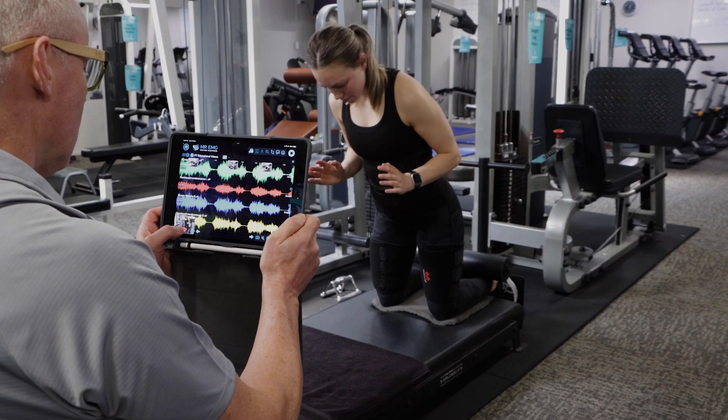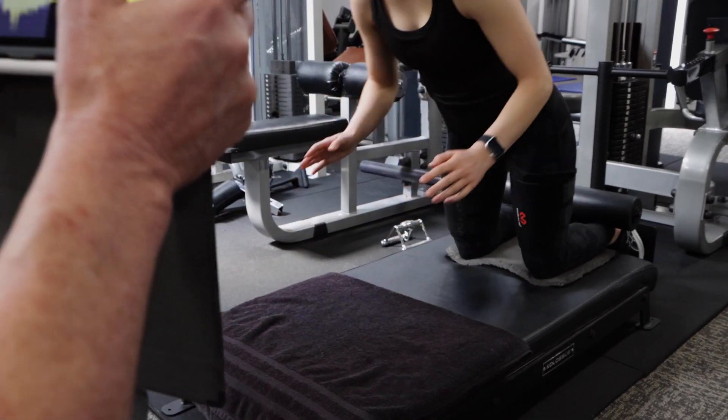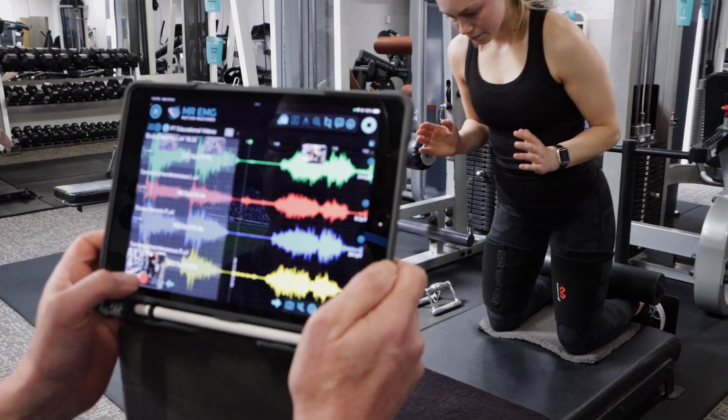Now we will test Nordic hamstrings. Ensure your client has good form and range of motion during each repetition.